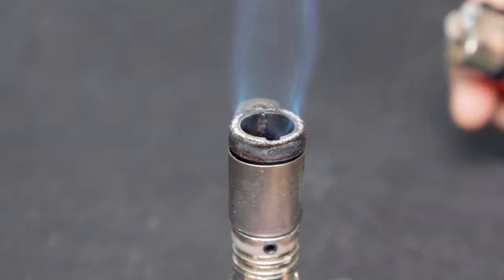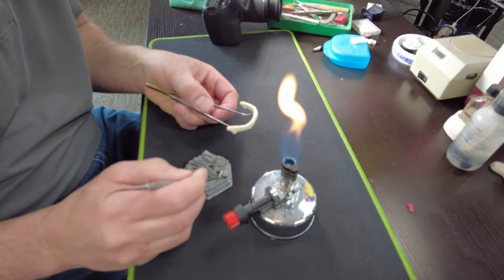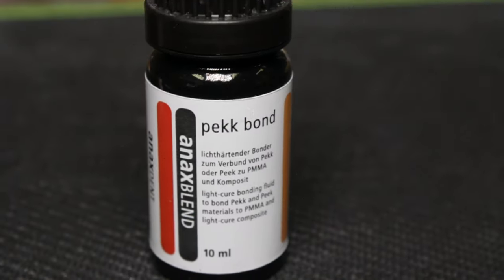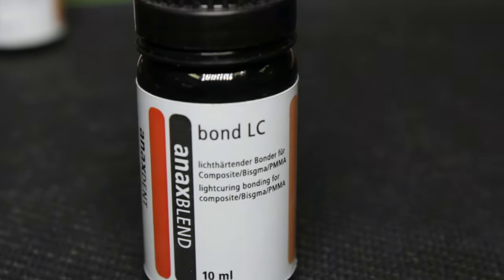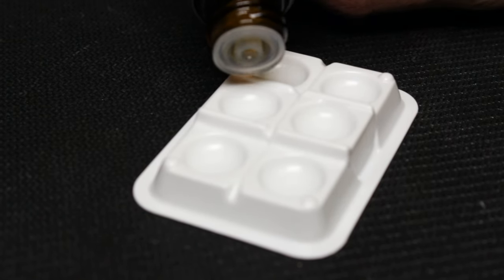Before fusing the Trilor bar and the nano ceramic jacket together, we need to close the screw access holes in the bar with wax. Another crucial step that is often overlooked is the application of a bonder onto the surface of both materials.